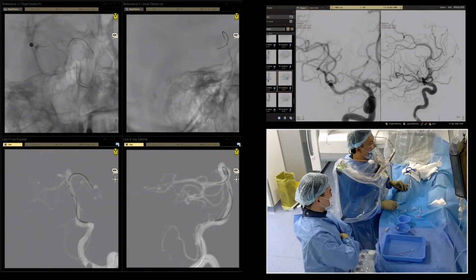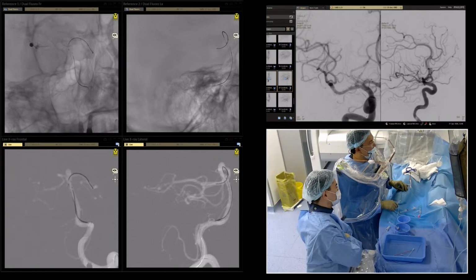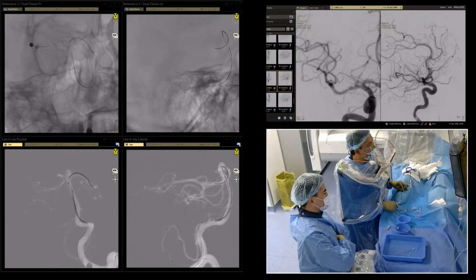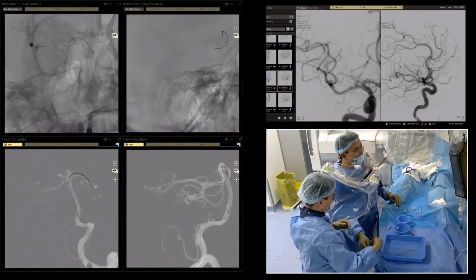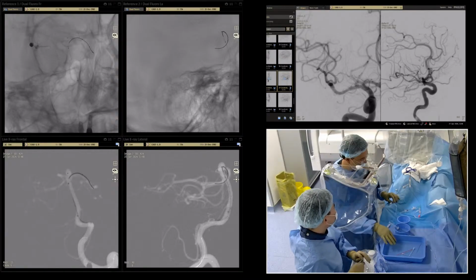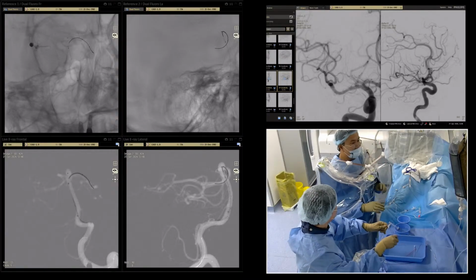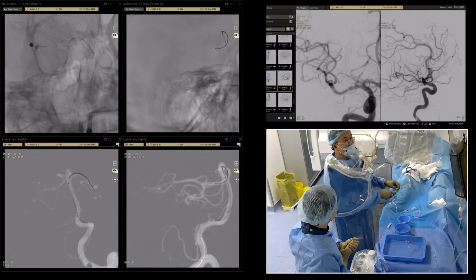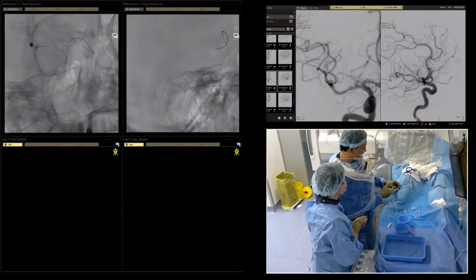Yes, because of the multiple aneurysms, it could be the vessel wall changing, especially like for yes, it's a web-shaped aneurysm, 6/3, which we have now. Okay, I will do one job. I will ask Roland to measure the aneurysm sizes.